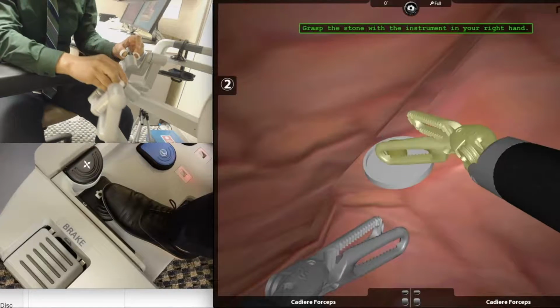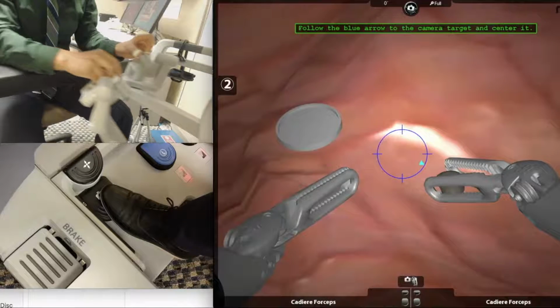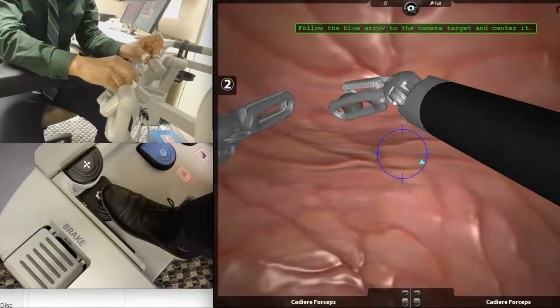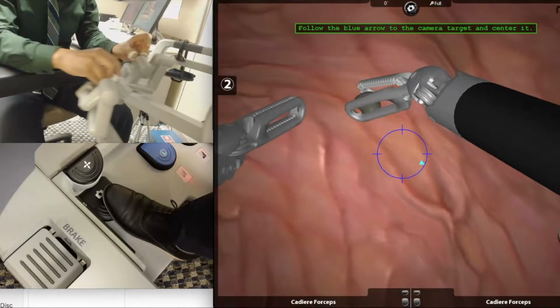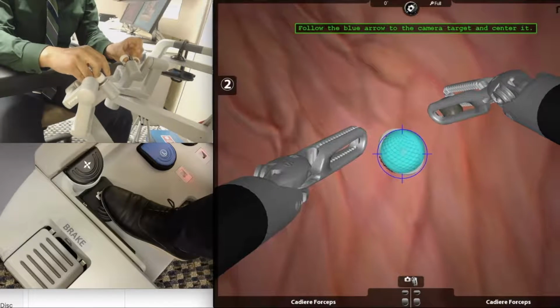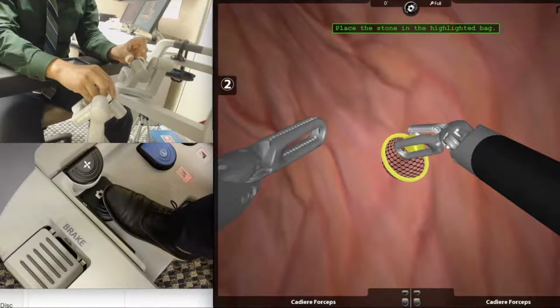Moving the camera is then a three-step process. You start by moving both arms as one unit towards one end of the screen, engage the camera, and push away till you get to the other end of the screen, and you repeat that until you get to your target. Care is taken to keep instruments in view of the camera at all times, as moving instruments out of view deducts points from your final score.